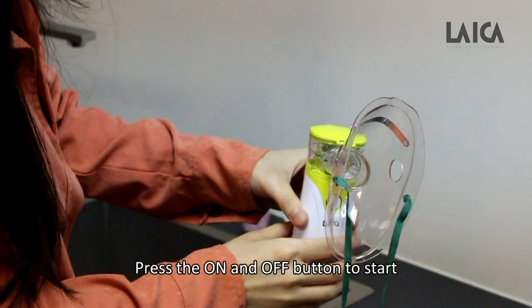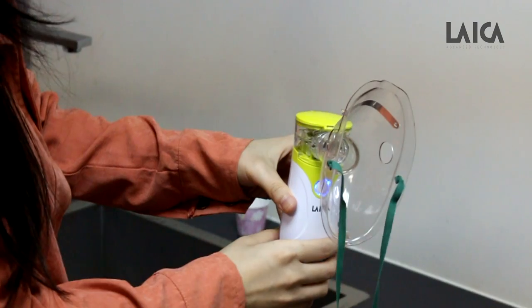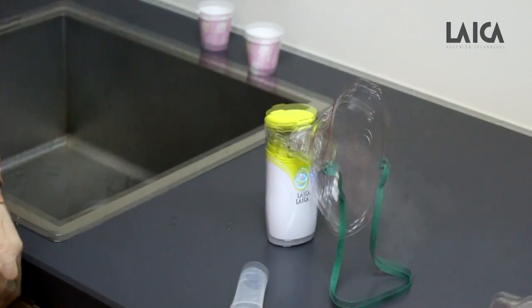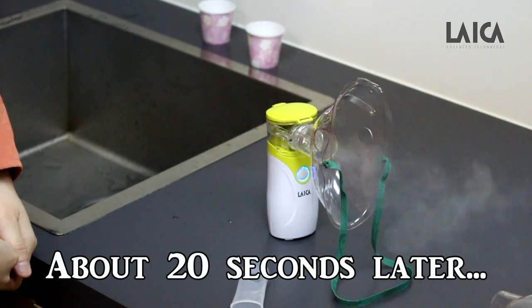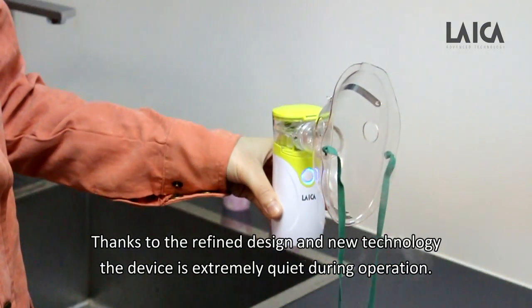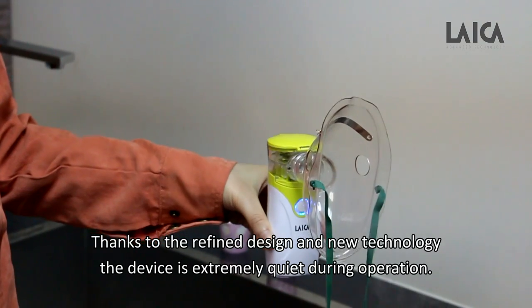Press the on and off button to start. Thanks to the refined design and new technology, the device is extremely quiet during operation.